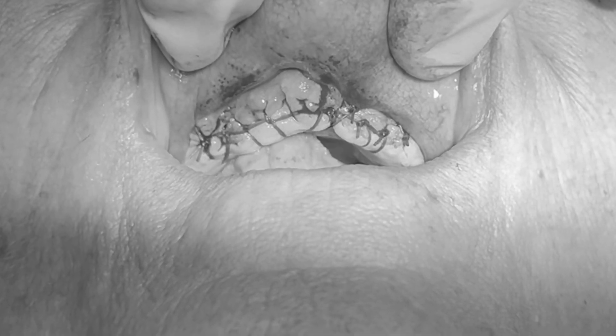Of course, I numbed this area before I did this, so the patient didn't feel anything, and then I closed it with dissolvable sutures.